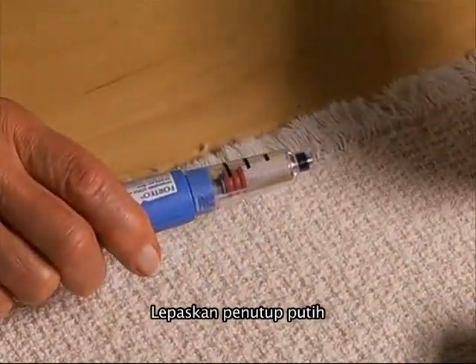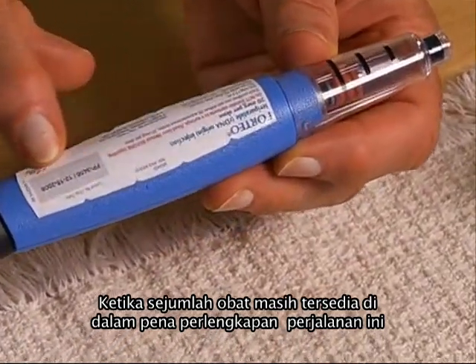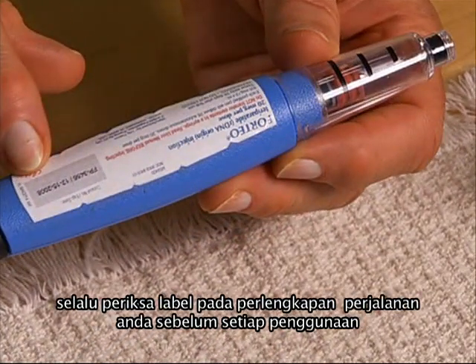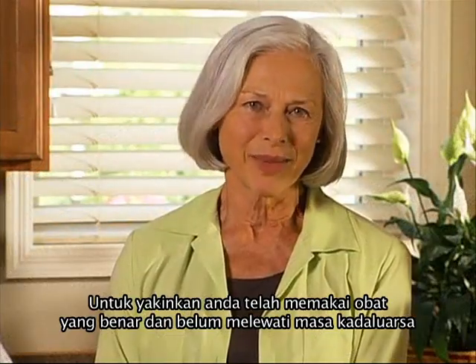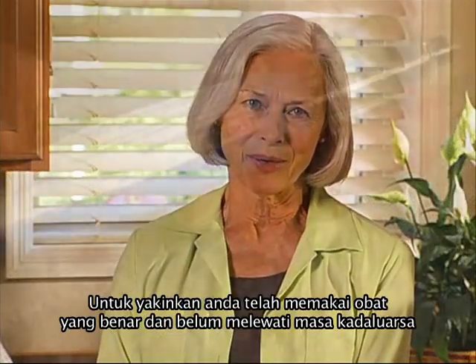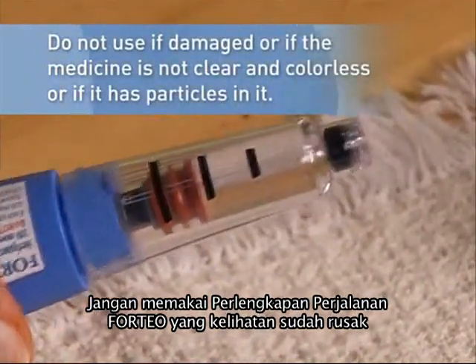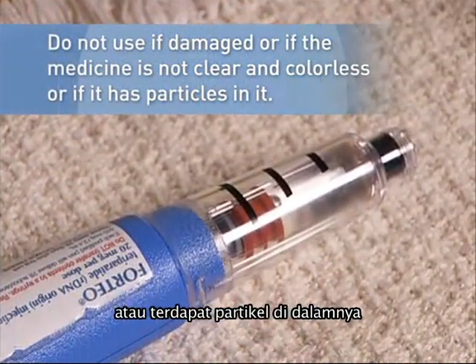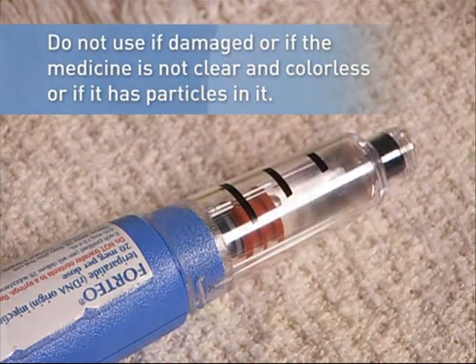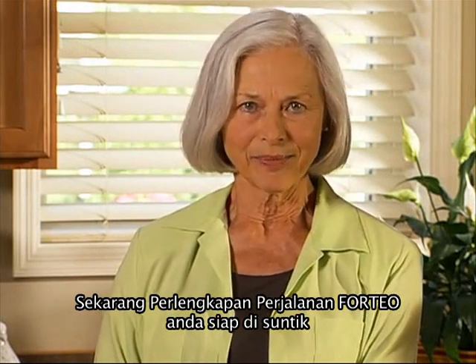Pull off the white cap. As a number of medicines are available in pen delivery devices, always check the label on your delivery device before each use to make sure you have the right medicine and that it has not expired. Do not use if the Forteo delivery device looks damaged, if the medicine in the cartridge is not clear and colorless, or if it has particles in it. Your Forteo delivery device is now ready for its needle.